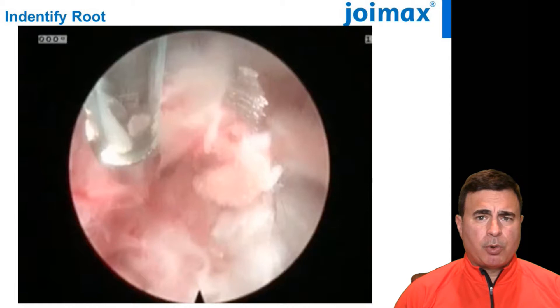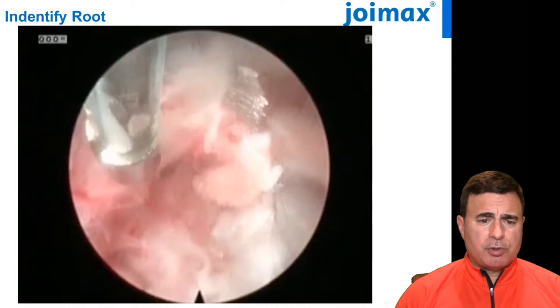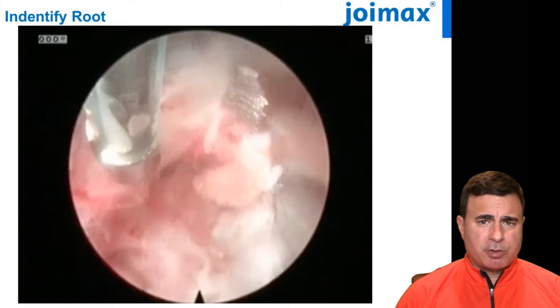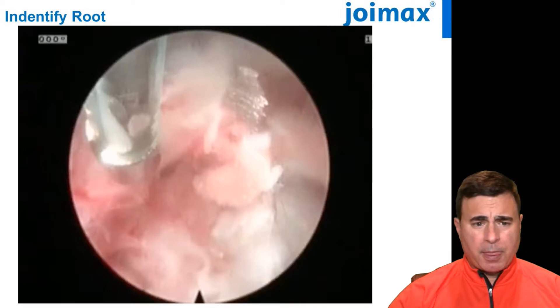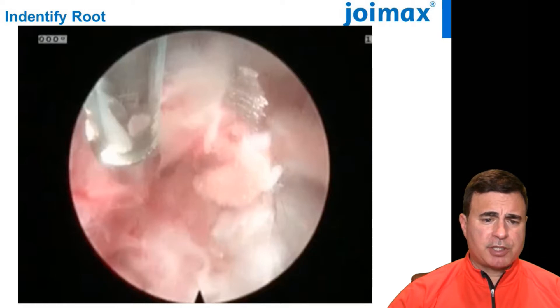I also think it's very important to identify the nerve root. In this example, you will see a nerve root going from the 8 to 9 o'clock position to the 12 o'clock position. You'll see how easy it is to identify this nerve root, and what a great view of the relationship between the disc and the nerve root is.